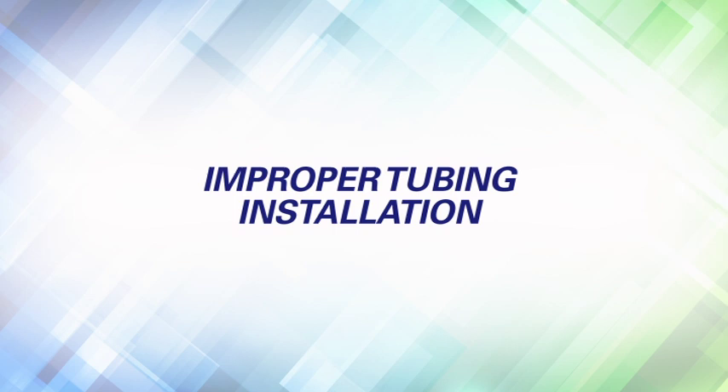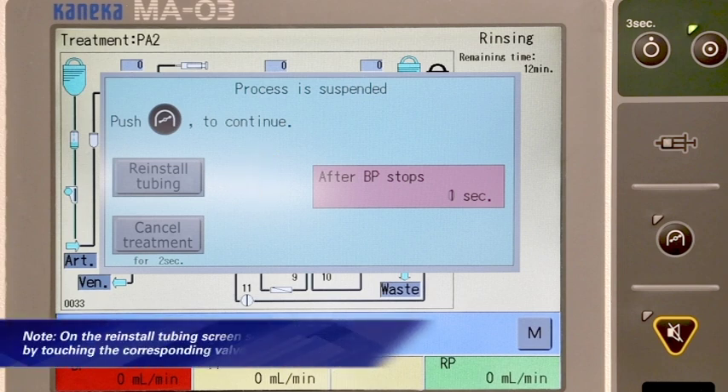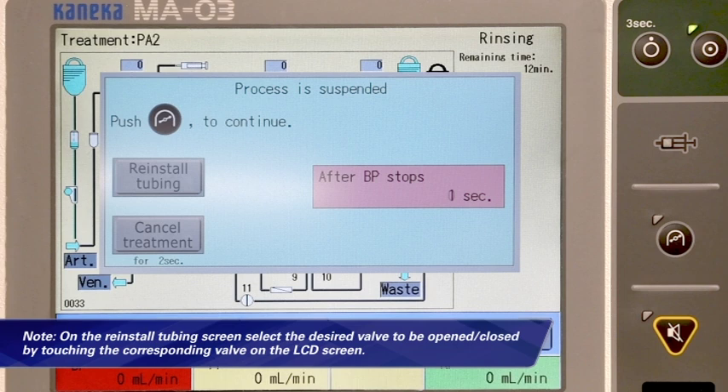Improper tubing installation. In case a tube is not properly installed in a valve, reinstall tubing can be selected during the rinsing process. Once the rinse process begins, press the blood pump button on the operational page — the process suspended screen will appear and you can select reinstall tubing. The reinstall tubing screen appears; touch any desired valve marking on the LCD screen to open the corresponding valve. Install the tubing line in the valve properly, then press the blood pump button to resume the rinsing process.